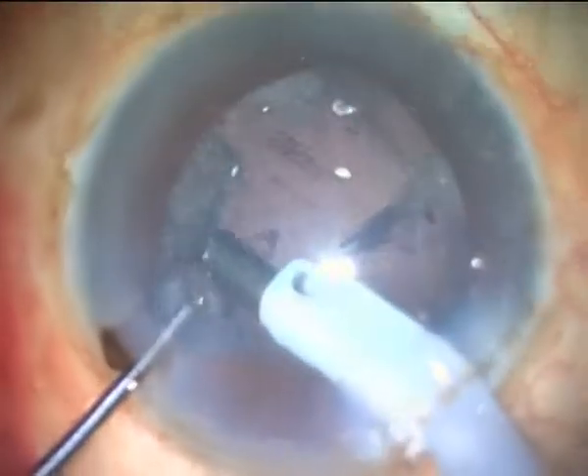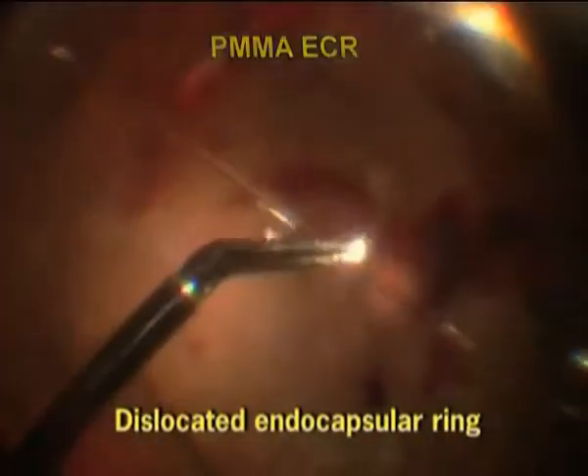Also, as the haptic is anchored in the sclera along its length, the chances of a post-operative drop of the ECR into the vitreous are also less, as compared to an endocapsular ring.